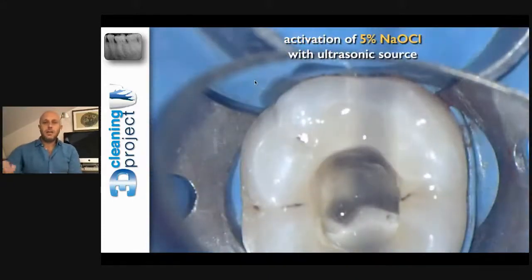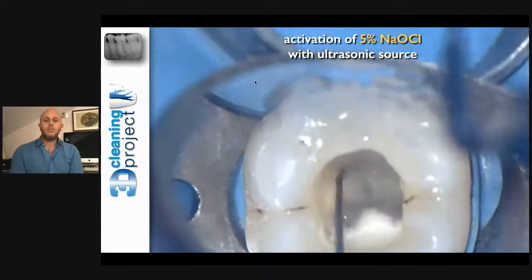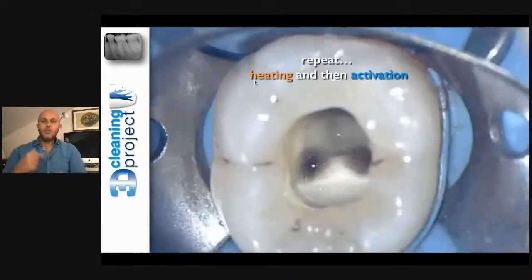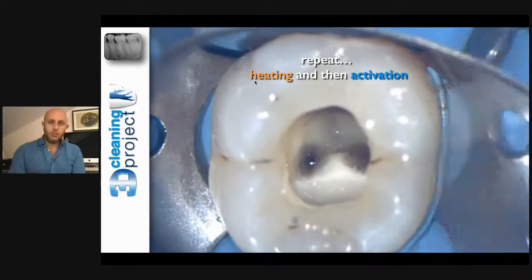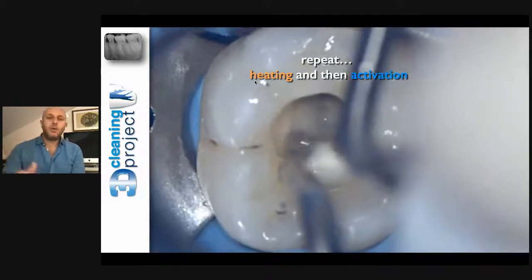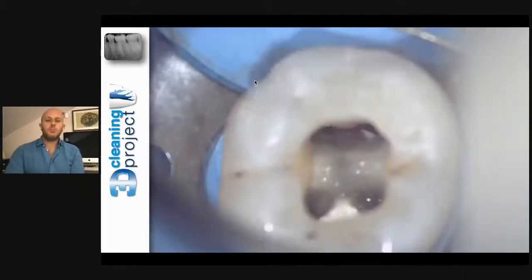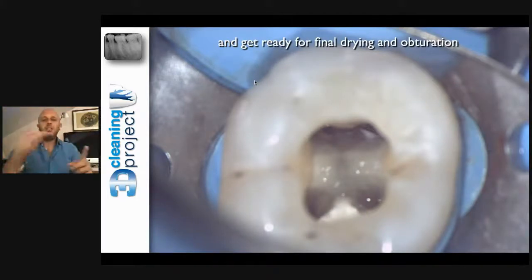Then I remove the heat carrier and I put inside the canal the ultrasonic tip to vibrate the irrigating solution for 20-30 seconds. Then I put new irrigating solution, I heat the solution, and I repeat the activation 4, 5, 6 times until I reach the best disinfection and cleaning possible. That's why we speak about 3-dimensional cleaning of root canal space, because we improve in the best way possible the action of irrigating solution in order to clean and disinfect the endodontic space and its complexities. Then after that, I'm ready to dry and to obturate the root canal.